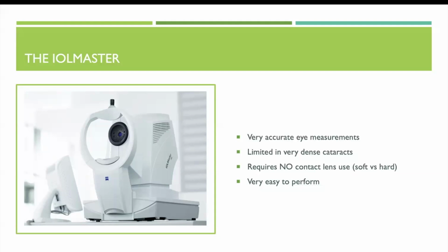But the thing that I wanted to mention here is that you want to remind your patients that if they are contact lens users, they need to make sure that those contact lenses have been removed for a specific amount of time before they have the biometry. Usually for soft lenses, it depends on where you work. The guidance will range anywhere from about 2 days up to about 2 weeks. And with hard lenses, again, 4 to 8 weeks is the usual guidance of not wearing those lenses before the biometry so that you're not getting the wrong result. And it's really very easy to perform. You can just follow the instructions on the machine, and usually you could just do it yourself.